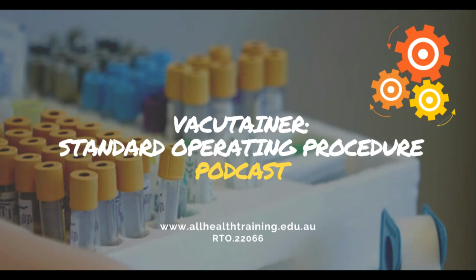Enter the needle and ground the back of your fingers against the patient's arm for stability. With your non-dominant hand, introduce your first tube into the barrel, using your pointer finger and middle finger on either side of the wings of the barrel, and pushing the tube on with your thumb. You will hear a click when it is secure. Blood should now be filling into your tube. Loosen the tourniquet.